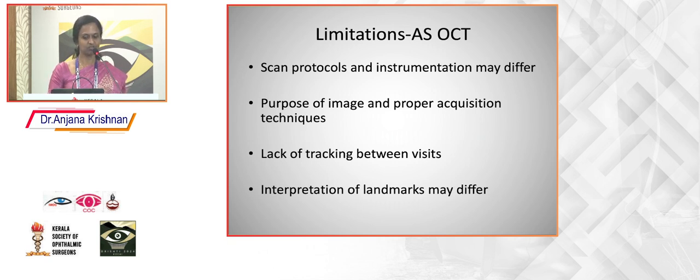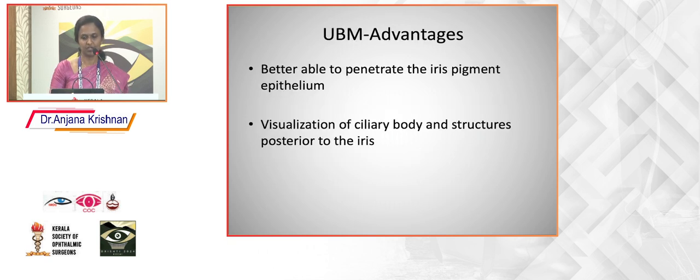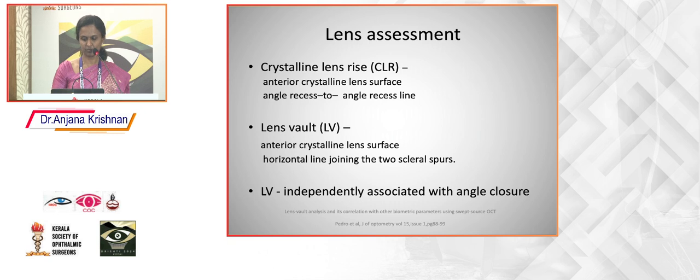The tracking between visits is found to be not very good with ASOCT, and the interpretation by the doctors also, the landmarks may differ sometimes. And the UBM, as already mentioned, has the advantage of penetrating the posterior pigment epithelium. In the lens assessment, the two terms which need to be known are crystalline lens rise and lens vault.